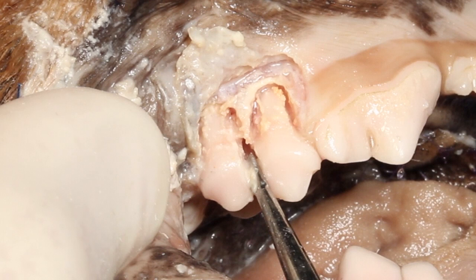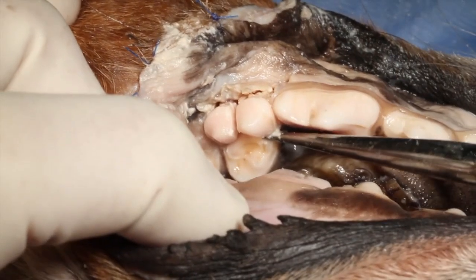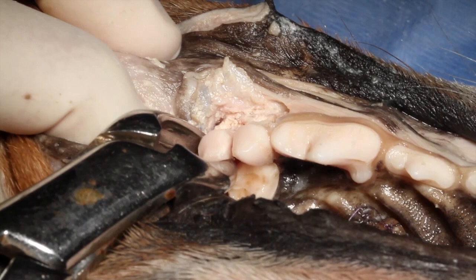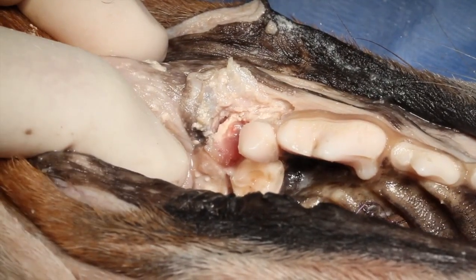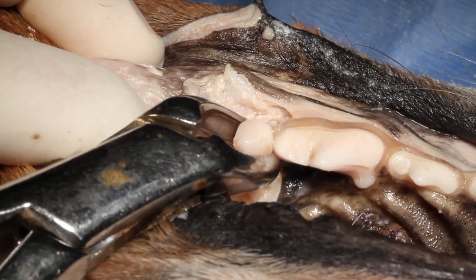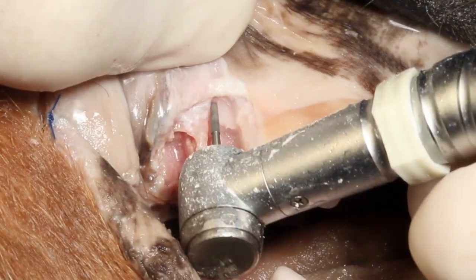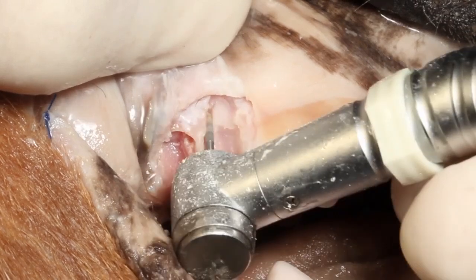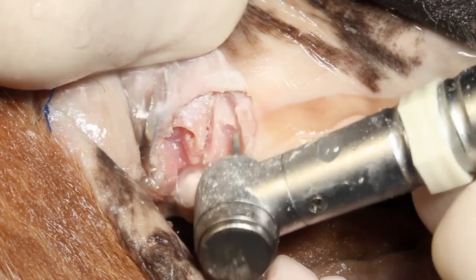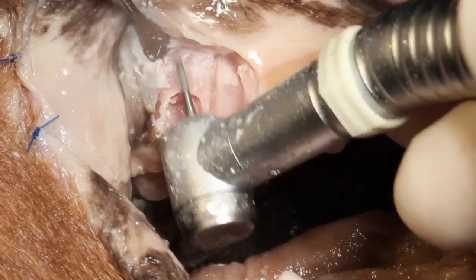Now what we'll do is purposely fracture these roots in order to demonstrate the proper technique for removing fractured root tips. We now have a couple of root tips several millimeters in length, and you can see we've exposed that root tip on the mesial aspect the same way that we expose the tooth root coronal to that.